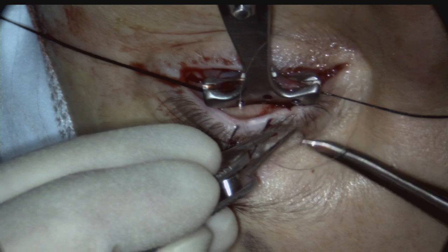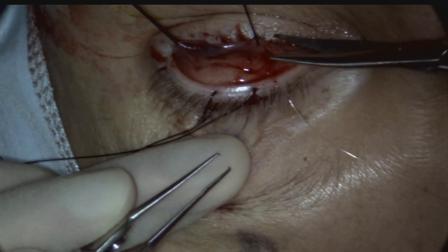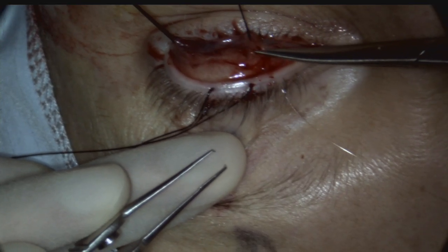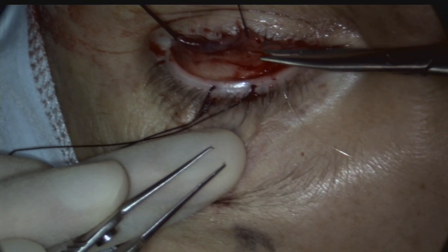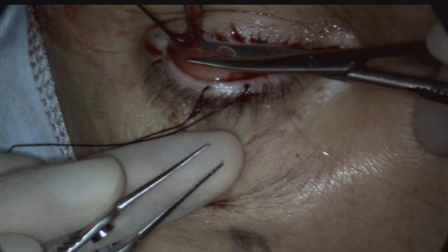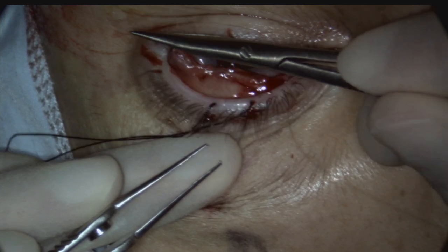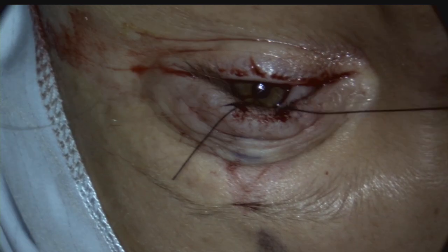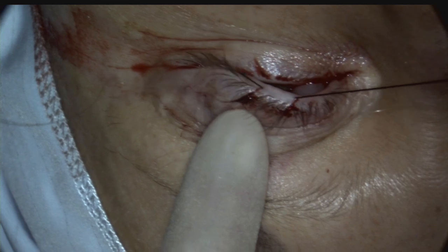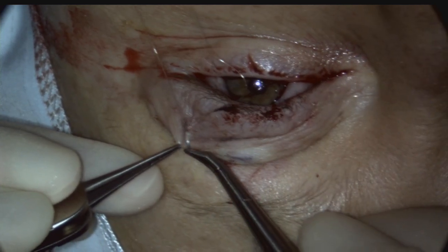The suture is brought out medially and externally through the skin crease. The clamp is released. Westcott spring scissors are used to excise the Muller's conjunctival complex, taking great care not to cut through the mattress suture. The grey-line 4-0 silk suture is removed, and the ends of the mattress suture are tied either to skin or the ends can be secured with Steri-Strip.